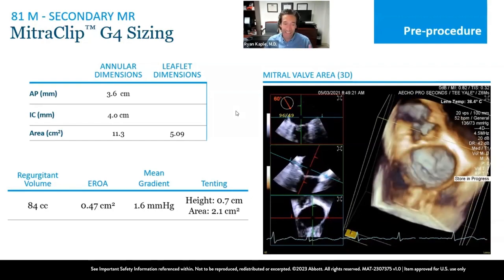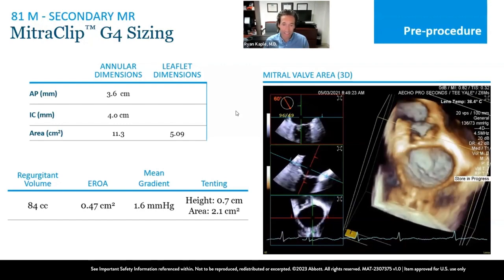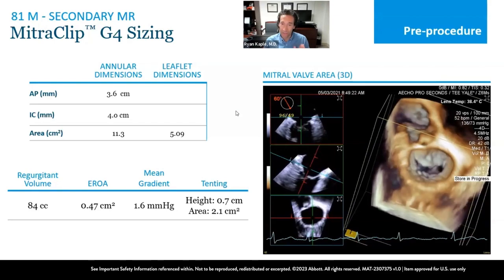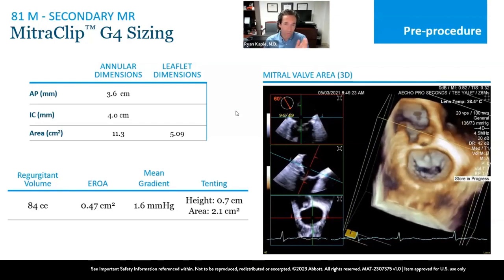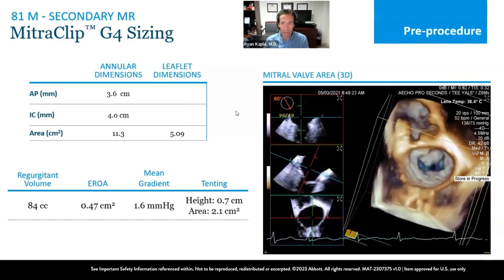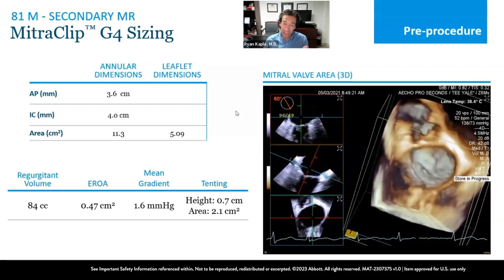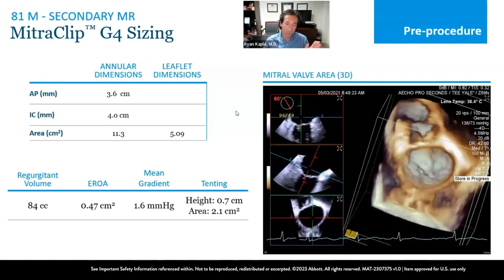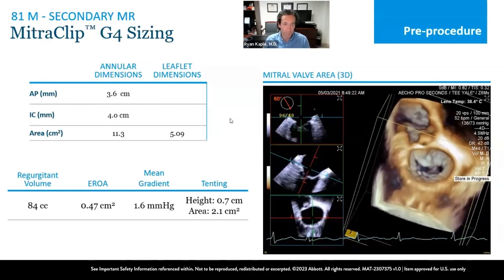When Nadira was speaking, I mentioned that it's helpful to be able to go back and to see what the baseline leaflet length is. Because in some patients with a contracted posterior leaflet, you really want to know the length of the leaflet right in that area where that pathology is, because it can be pretty focal. If the leaflet is very short, you may have to go on one side or the other. And so if you have a sweep through the area, you'll be able to identify the difference there.